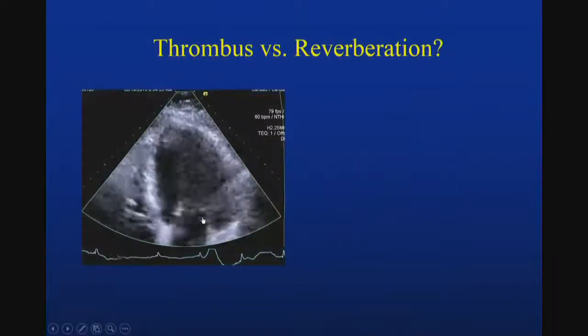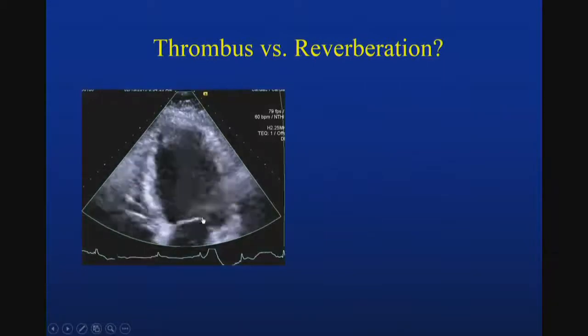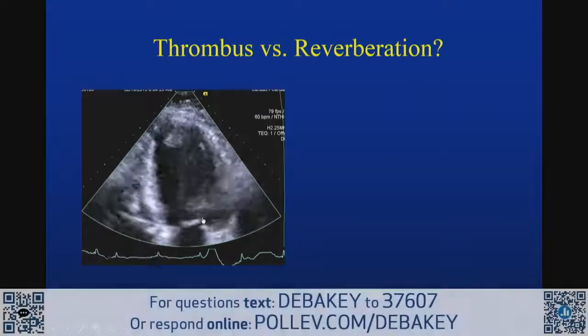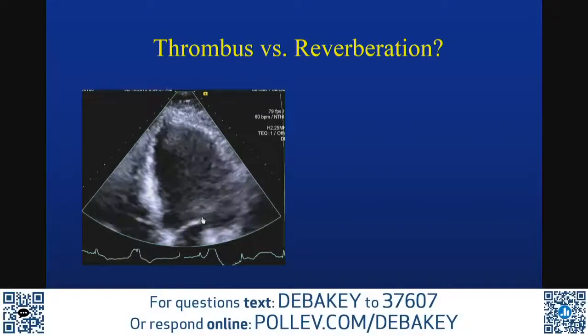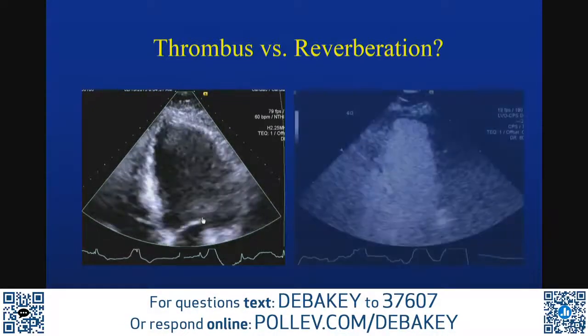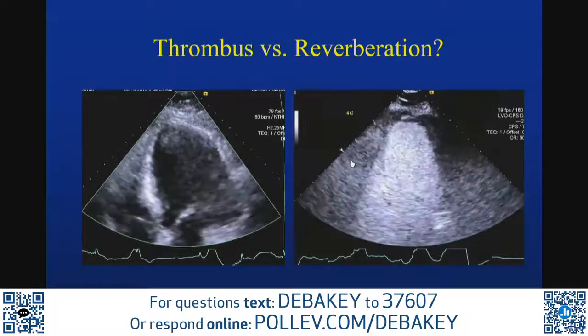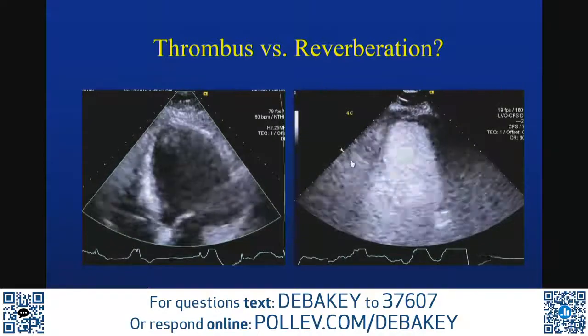And let's take some examples here. You decide, okay, wherever you are. Is this thrombus or is this reverberation? Okay? I don't have a way to poll you, but you make that decision. I don't know if you're surprised. I was personally surprised, but there's no thrombus.